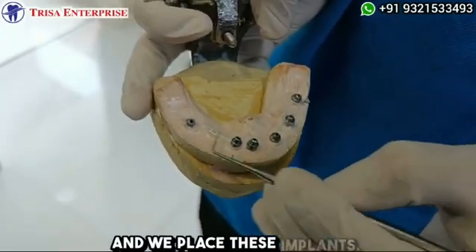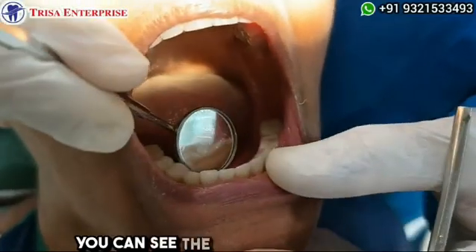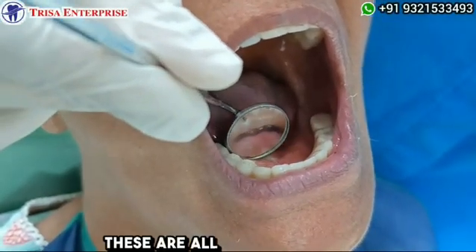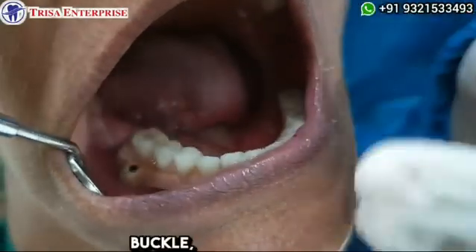Let me show you in the mouth as well. You can appreciate the screw holes in the patient's mouth — these are all the screw holes, and you can see the buccal screw hole over here.